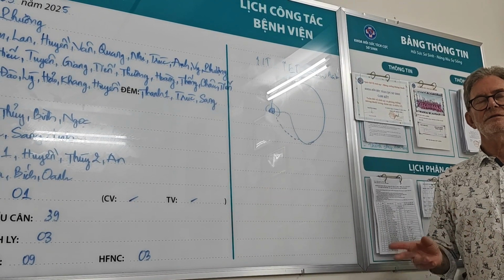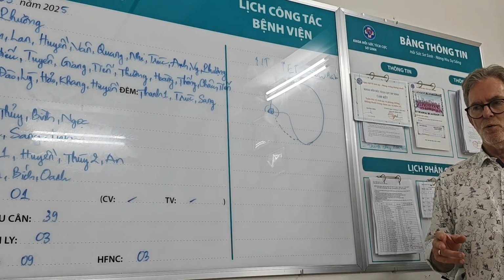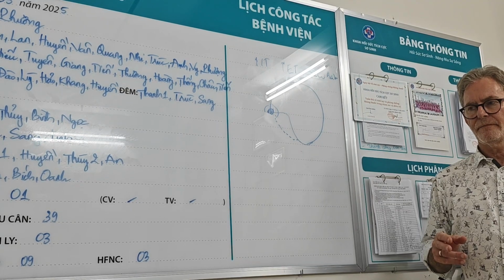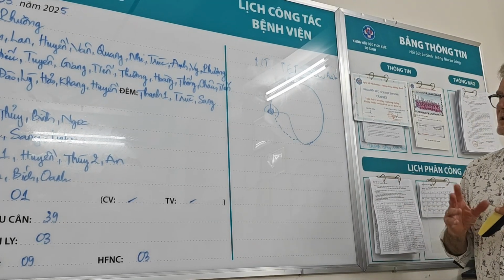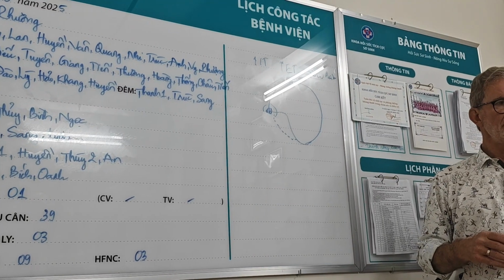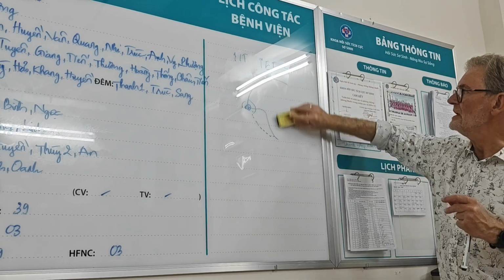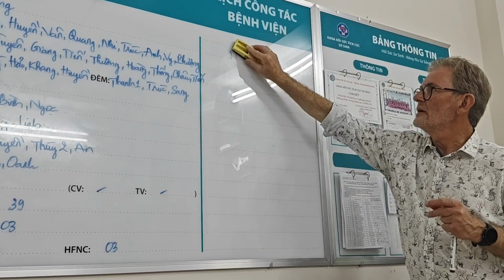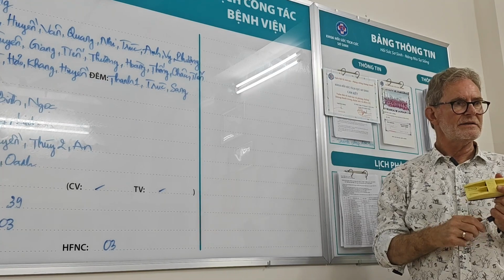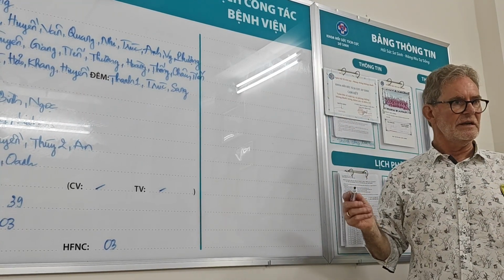I'm just trying to think in terms of acute RDS, do we ever see auto-PEEP? Again, the only time I can think of auto-PEEP in acute RDS is sometimes if you try to use higher rates. So I generally don't go over a rate of 60.